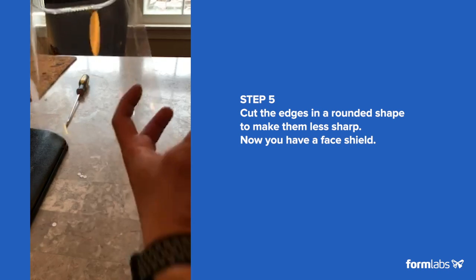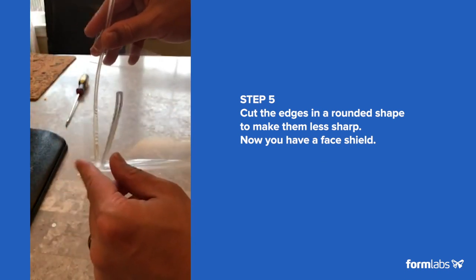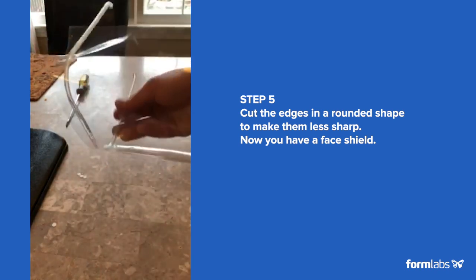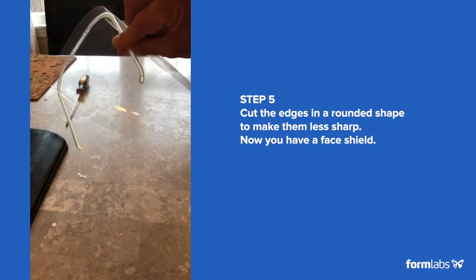Just cut the edges slightly on the side to prevent people from getting poked by the edges, but that's pretty much it. That's the OxiFrame file too. Thank you.